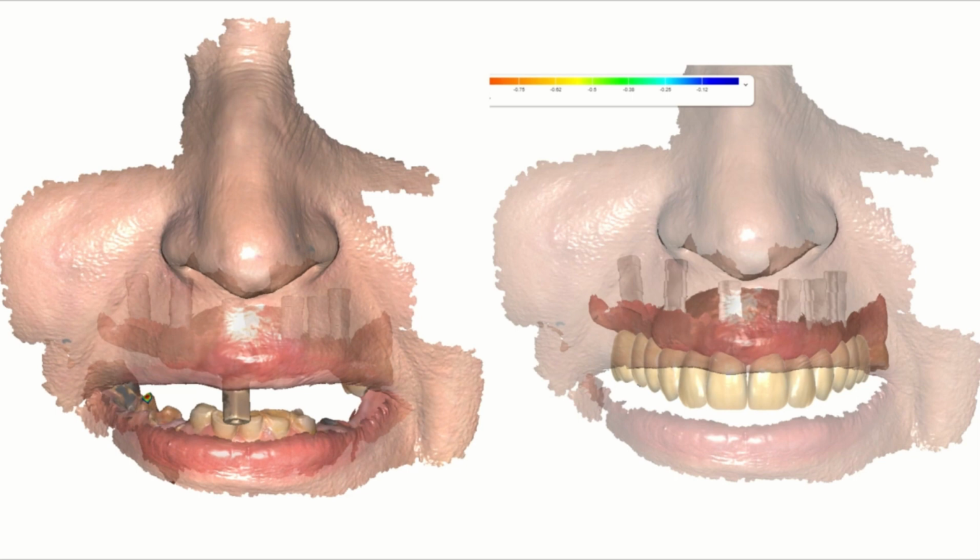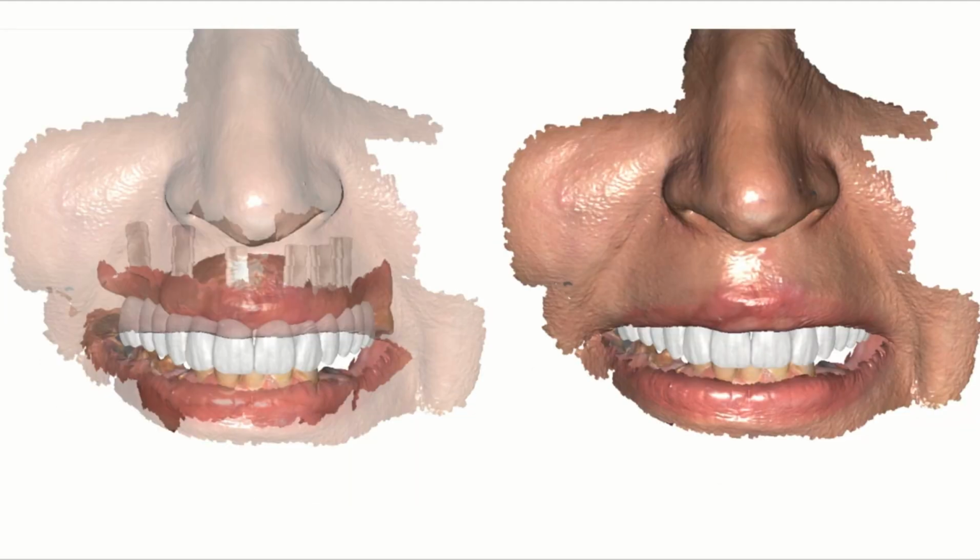Here is the prosthetic part. In my opinion, an intraoral scanner will make your prosthetic part very easy. No more nightmares in the implant prosthetic phase. All you need is an excellent, accurate intraoral scanner that can capture soft tissue well, especially in the lower arch. Of course, lower arch scanning is completely different from the upper arch, especially in full arch cases.